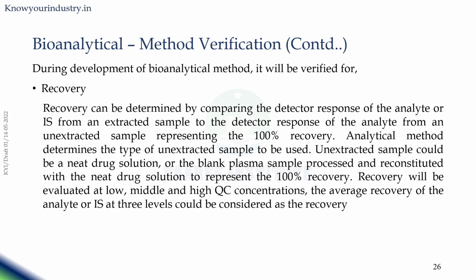Now we are coming to the important parameter, recovery. Recovery is sometimes confused with accuracy, but recovery is actually explained here. Recovery can be determined by comparing the detector response of the analyte or the IS from an extracted sample to the detector response of the analyte from an unextracted sample, representing 100% recovery.